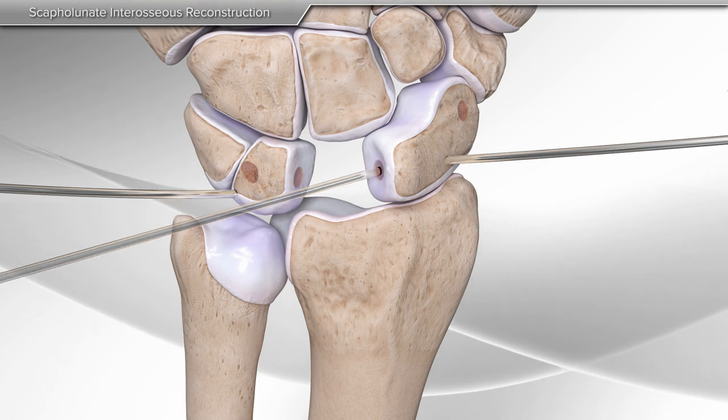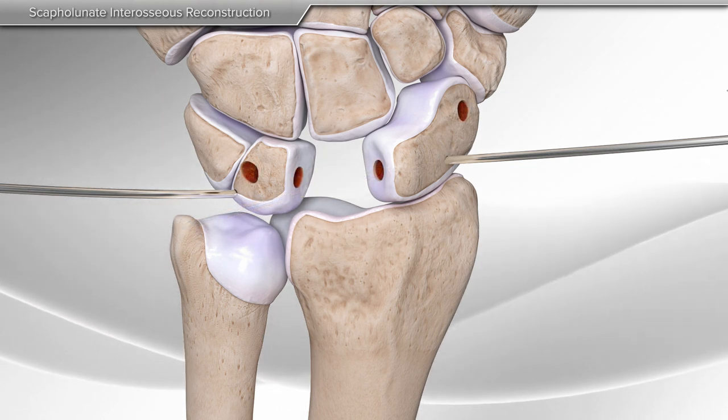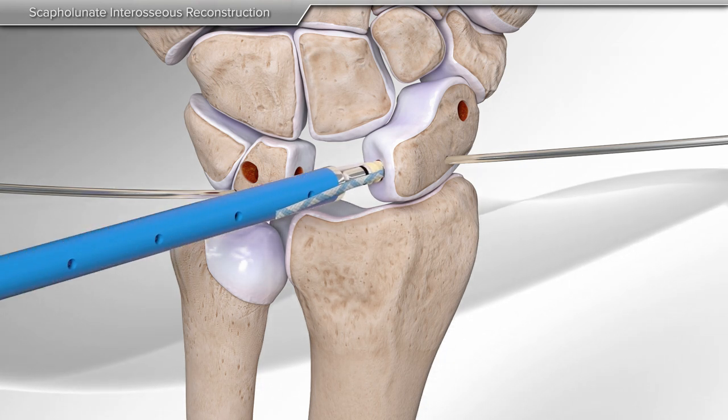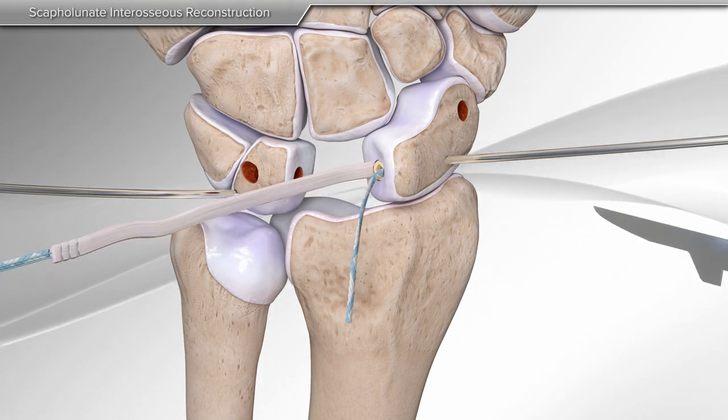Next, your surgeon will make holes in the lunate and scaphoid in preparation for placement of the tendon graft. One end of the tendon graft, along with suture tape, is inserted into the first hole on the scaphoid.